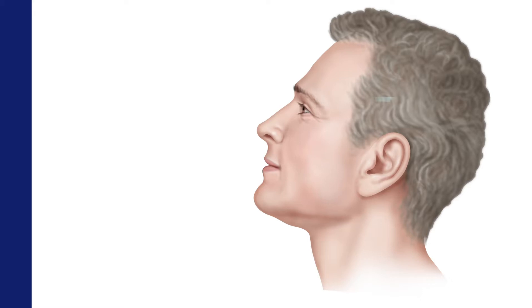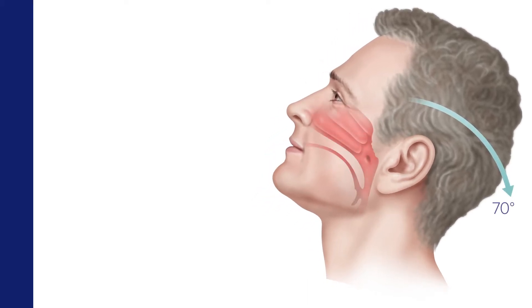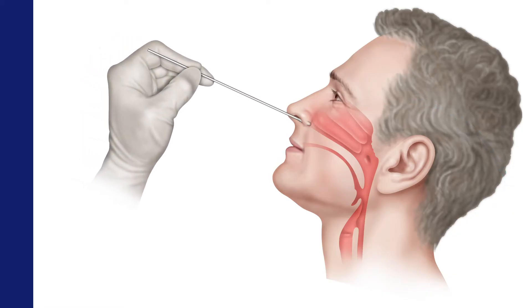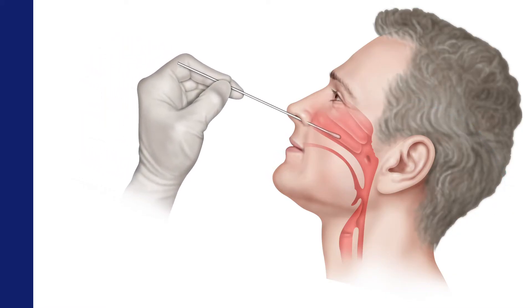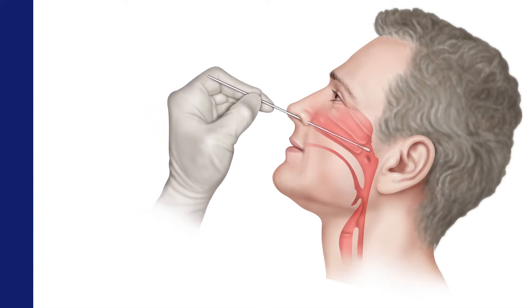Now, tilt the patient's head back to a 70-degree angle and check for nasal obstructions. Then gently insert the swab straight back into the patient's nostril, aiming posteriorly along the floor of the nasal cavity until reaching the posterior wall of the nasopharynx. Keep the swab near the septum floor of the nose, gently pushing the swab into the post-nasopharynx.